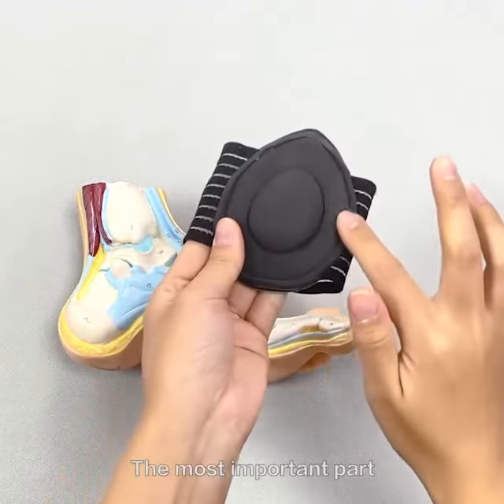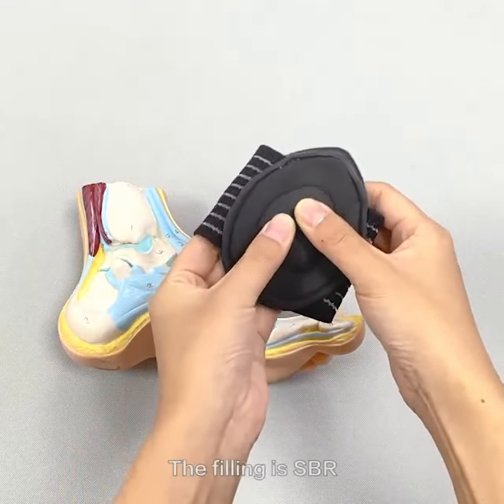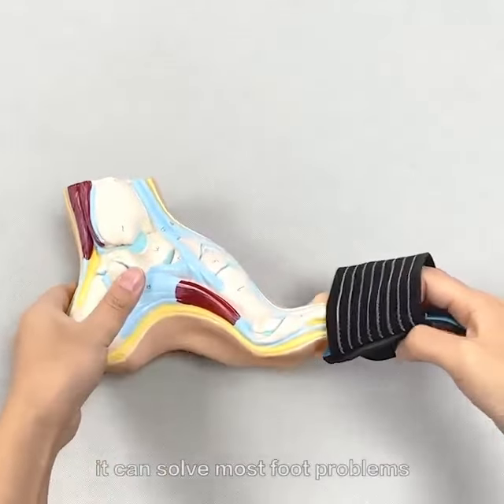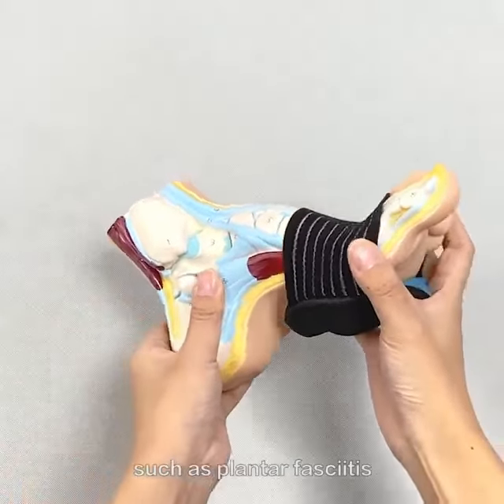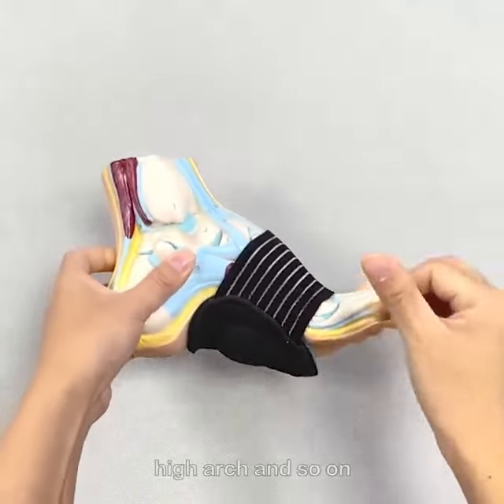The most important part is the arch support arthritic pad. The material is SBR. It can solve most foot problems such as plantar fasciitis, flat foot, high arch, and so on.